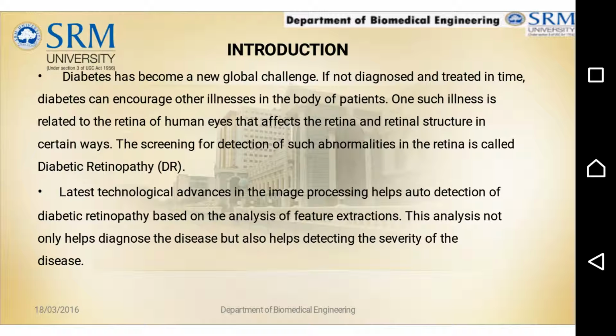If not diagnosed and treated in time, diabetes can lead to a series of illnesses in the human body. It can also affect the retina and retinal structure of the human eye in certain ways. This screening for detection of such abnormality in the retina is called diabetic retinopathy.